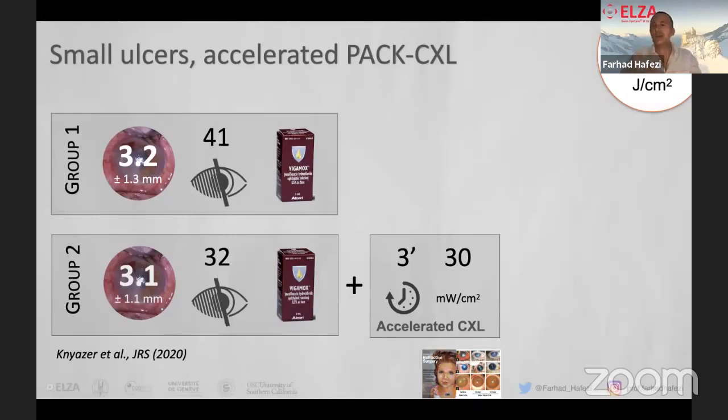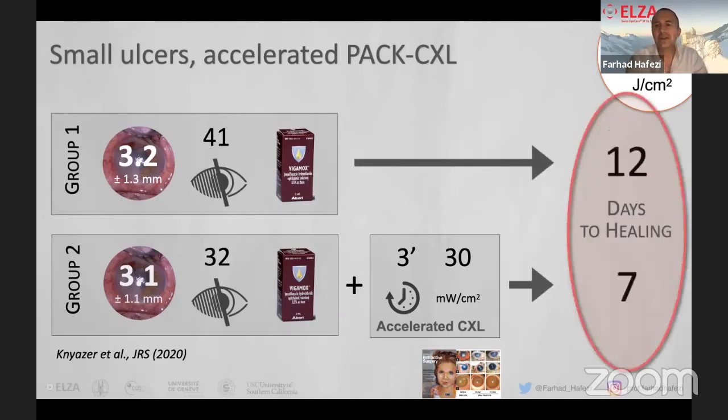Still, the total energy is the same as we usually have. That's the upper right, 5.4. And here we had a very nice result: much faster time to healing, significantly faster, which means less follow-ups, less aftercare, and a higher probability of healing the ulcer without losing the patient in the follow-up.